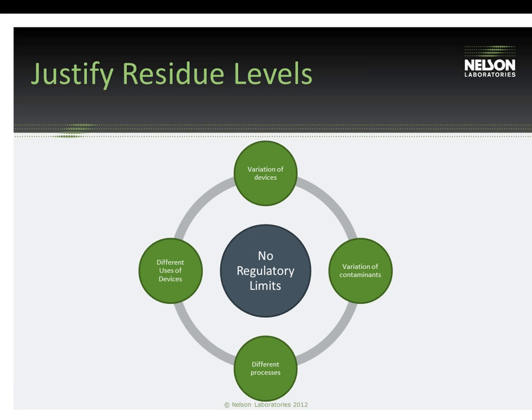For example, how can you say that if you have 1 milligram, for example, of residue, and less than that you have a clean device? It's been very difficult to come up with one number. And so that's kind of why there's a lack of acceptance criteria guidelines in the industry for these cleaning validations.